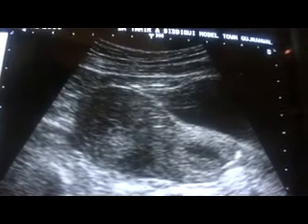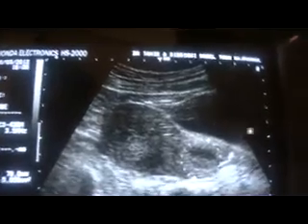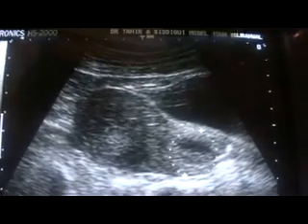Answering this question is very simple. First of all, try to go transverse. This is the cystic area in transverse section. Move it into transverse section and then again into coronal section. A cyst will not change its shape — that is the first criteria for a cyst. This cystic area changes its shape, which is consistent with the urinary bladder. Second thing: if you ask the patient to micturate, whichever is the urinary bladder will disappear and one will remain.